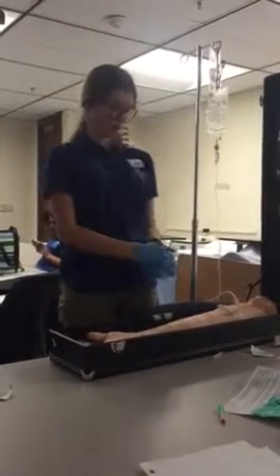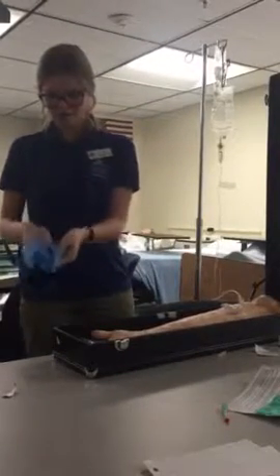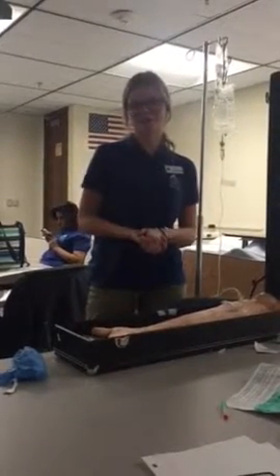Okay. And then at the end, I would take off my gloves, wash my hands, and I would document on the MAR the drug, the dose, the time I started it, the route of the drug, how the IV and the site was looking, and the volume I delivered on the intake and output. That's it.